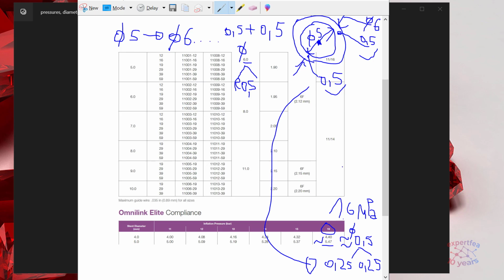So this is why I'm justifying what I will do next. I will choose a value between 0.5 and 0.25, and this value in my case will be 0.35. I want to push the scenario a little to make it kind of a worst case scenario or something like this. Let's go back to the simulation.